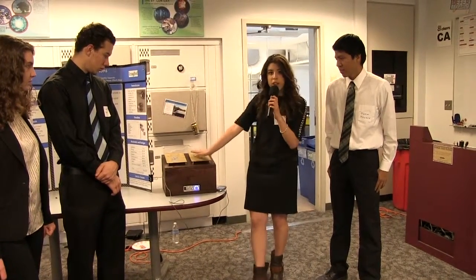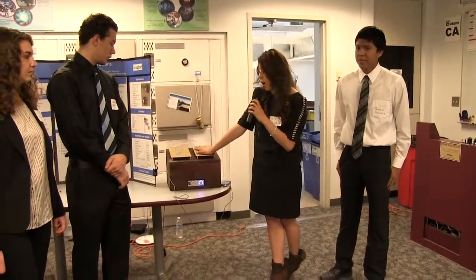Should you place your hands on these metal plates right here, stationed by metal standoffs on top of our box, you'll be able to feel some very strong vibrations, which mimic the vibrational patterns of the actual music themselves. So again, just giving them that opportunity to go ahead and feel the greatness of music by itself.